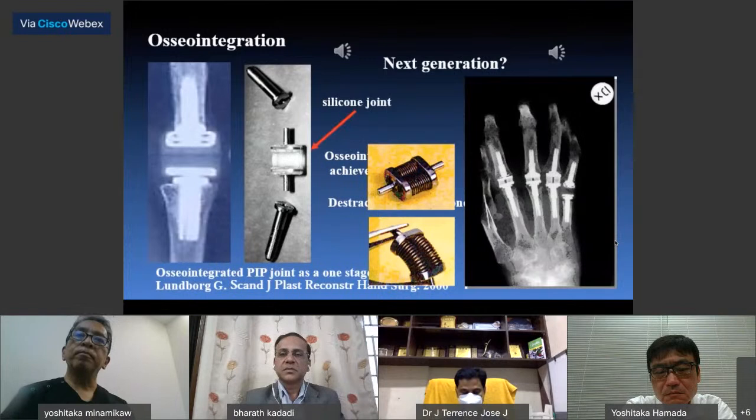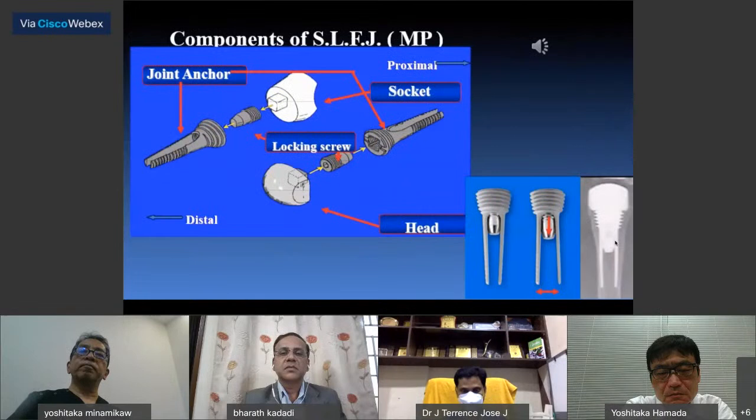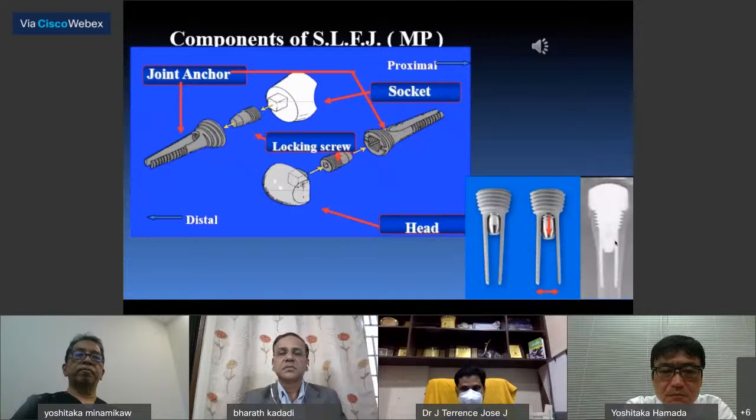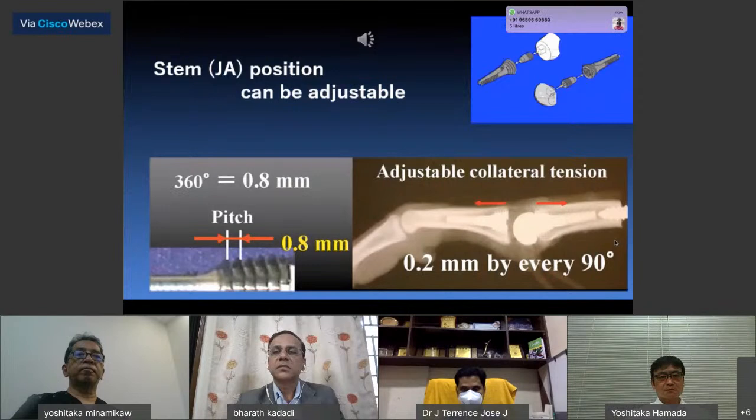I combined osseointegration and surface joint. This shows the components of the self-locking finger joint. Cobalt chrome head and plastic socket are connected to the square recess of the joint anchor. The titanium joint anchor has a tapered screw with expandable legs. Stem position can be adjusted during surgery, thus controlling collateral tension.